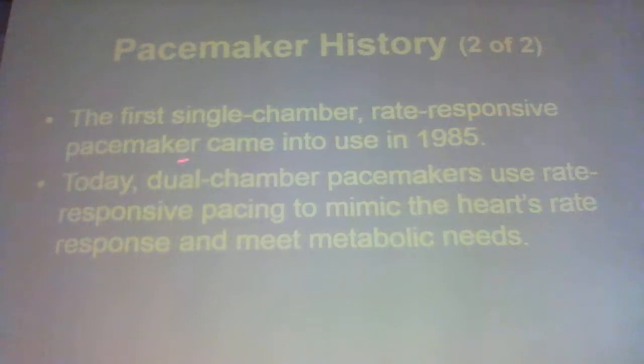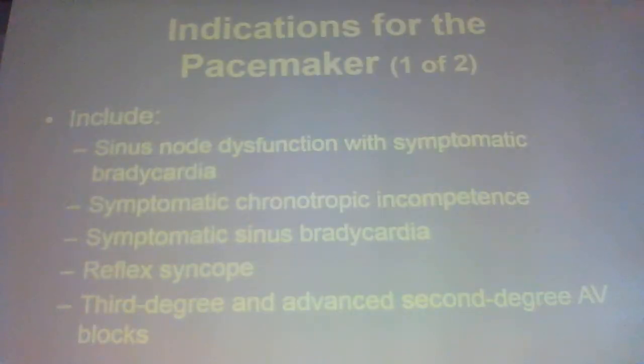Single chamber rate responsive pacemaker, what does that mean? It's only going to kick in when it needs to, on demand, right? Yep. Today, dual chamber pacemakers use rate responsive pacing to mimic the heart's rate response and meet the metabolic demands of the body. So, who gets pacemakers? People with sick hearts, right? People with sick hearts. Reflex syncope, symptomatic sinus brady, third degree blocks, second degree type 2 blocks, sick sinus syndrome.